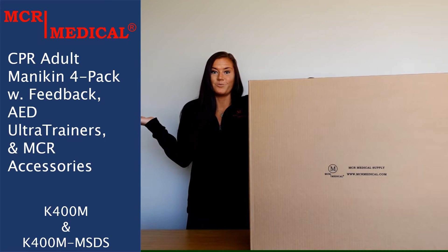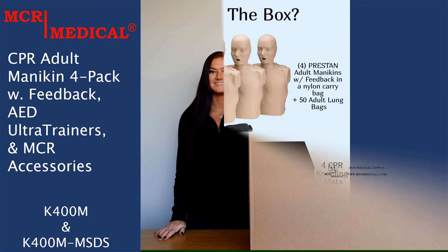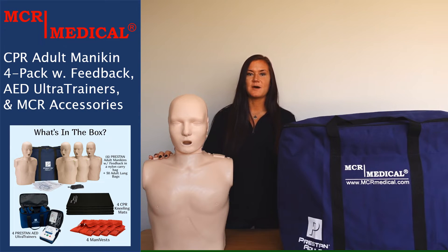So what's in the box? I wanted to highlight a few things about the Preston professional adult mannequins that are included in this kit, but for more helpful information please feel free to check out the videos I have linked below. These mannequins include the rate monitor feature, making them fully compliant with current American Heart Association guidelines.